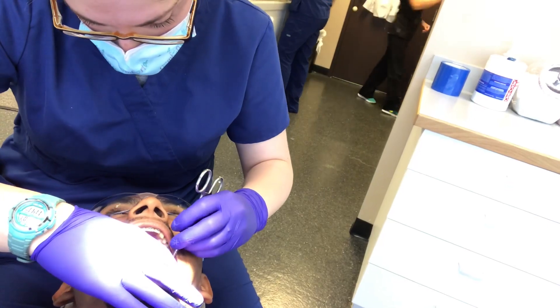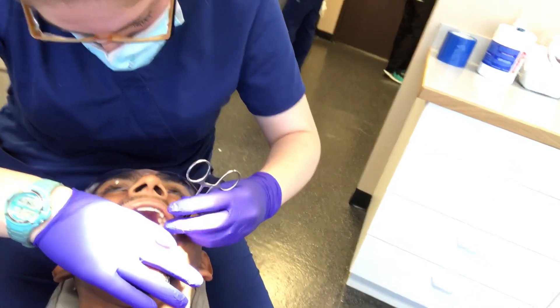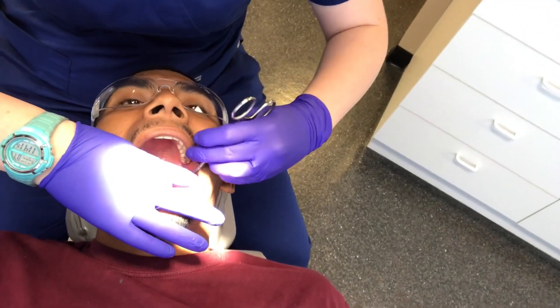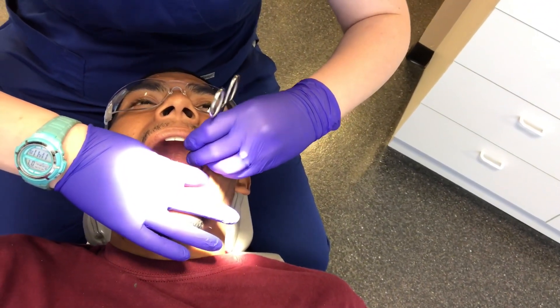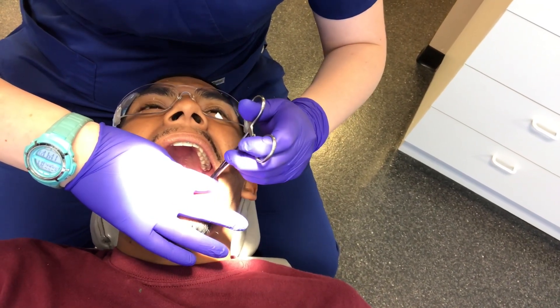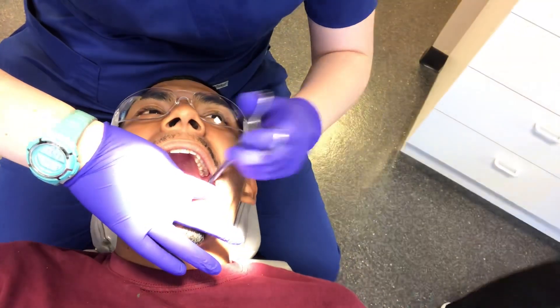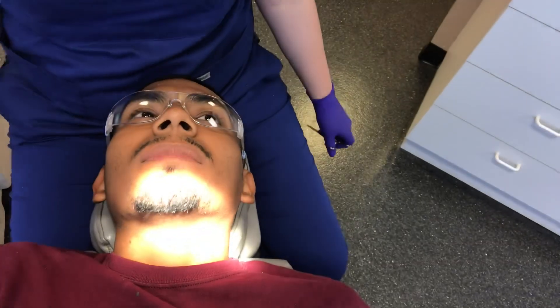Don't let it scare you that it's metal — it's actually a little easier. Same thing, you might feel a little pressure, but nothing crazy like what I just did to you. So there, it's pretty much in. I'm going to push a little bit. And that's it, it's in. See? Isn't that easier?